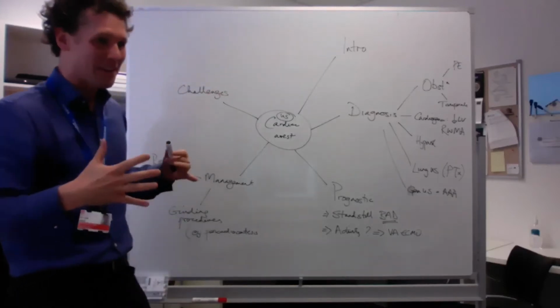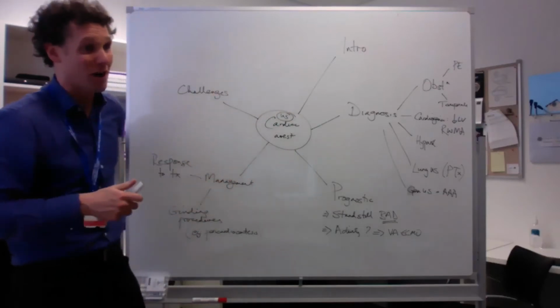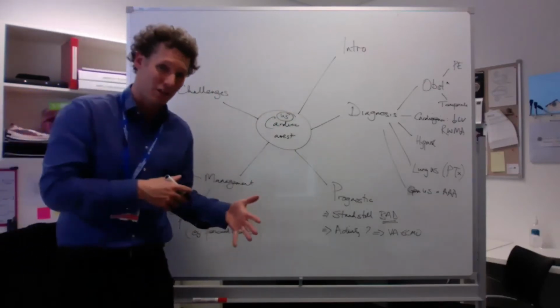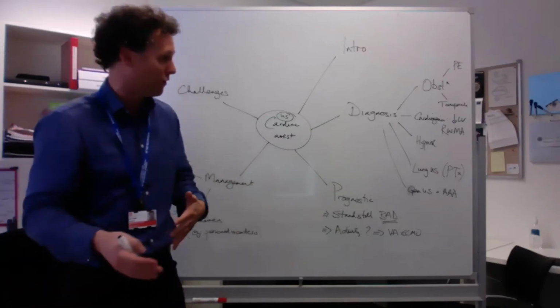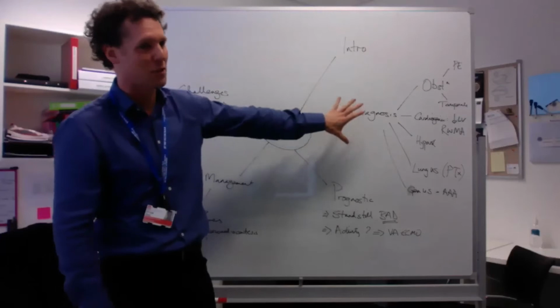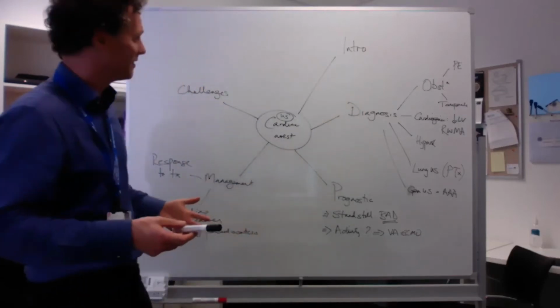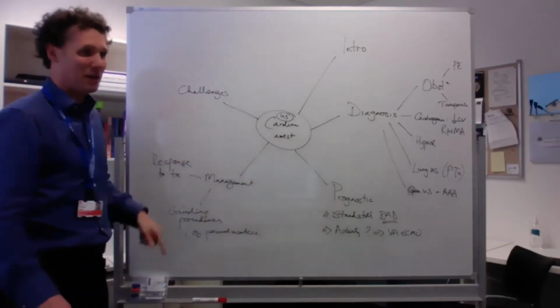It's the same thing we talk about every time. We go through a question like this talking about the clinical relevance of it, and being clinicians doing this exam rather than sonographers. Everything that you've said is right. And of course there must be something you write in this question about diagnosis. But some of the stuff that I really like in this is talking about this bit here.